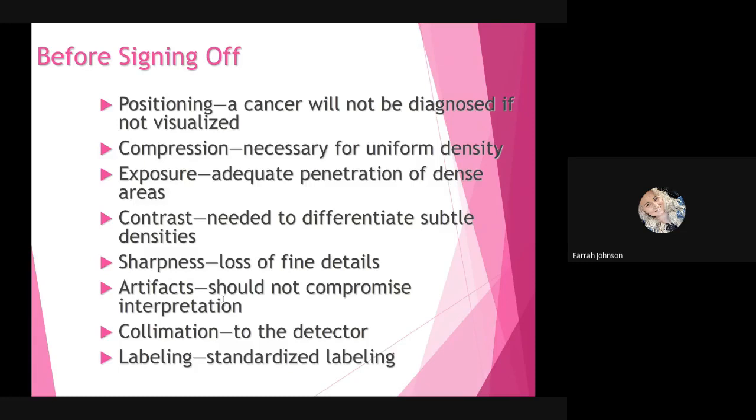Exposure, we want to make sure that we get adequate penetration of dense areas, especially in younger women with a lot of glandular tissue. Also, good contrast. This is needed to differentiate subtle densities. Sharpness, loss of fine details. We want to be able to see the breast tissue in great detail and with a level of sharpness.